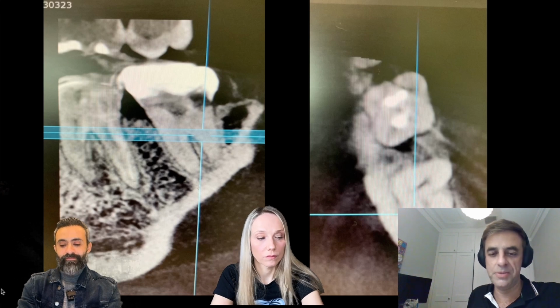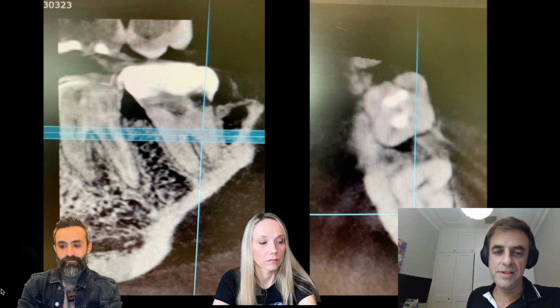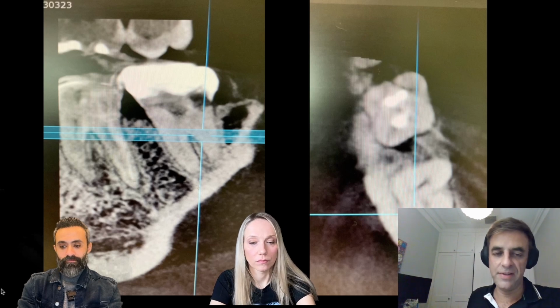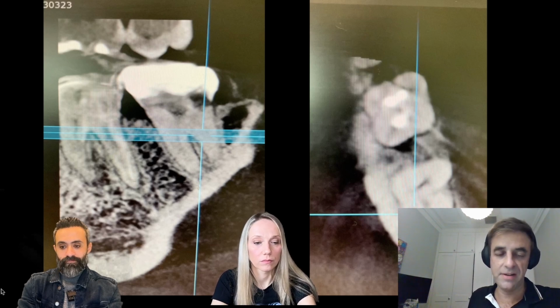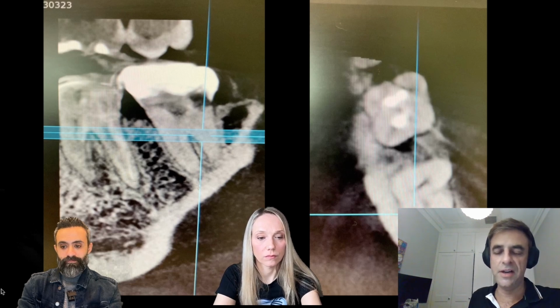We can see how deep the resorption is. It's at the alveolar bone level. So you're going to struggle to put a ferrule around that tooth, which obviously needs to be done because the crown that's on the tooth currently doesn't fit. So it gives you all that information, and all of a sudden you go, "Wow, the seven's not restorable."